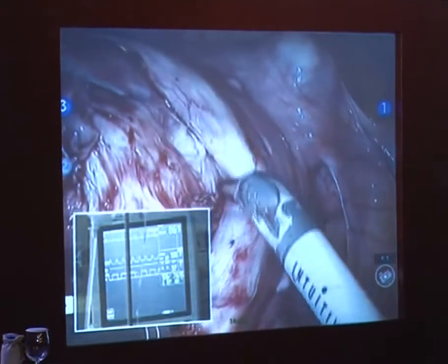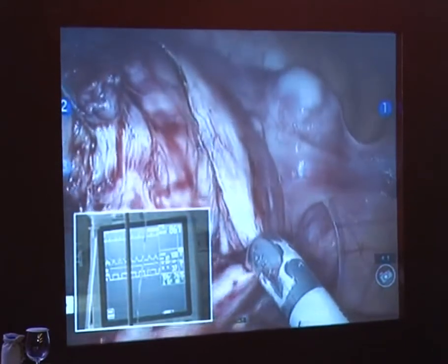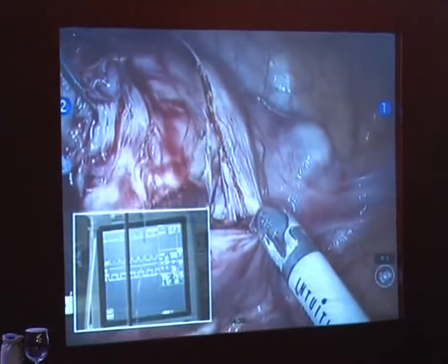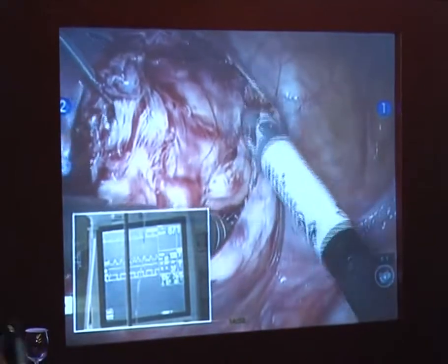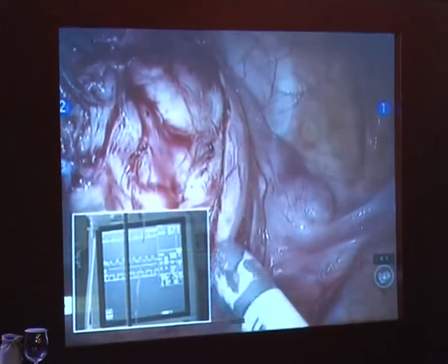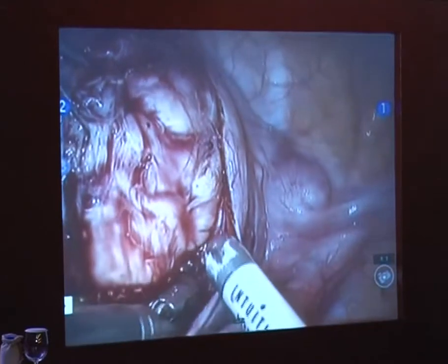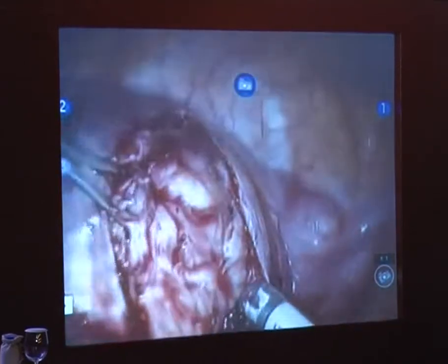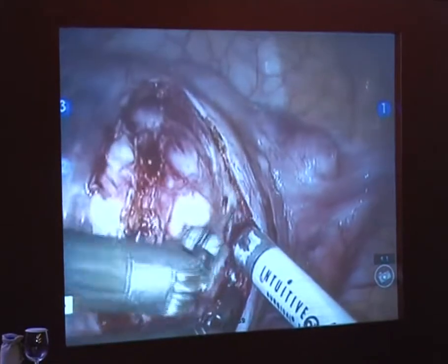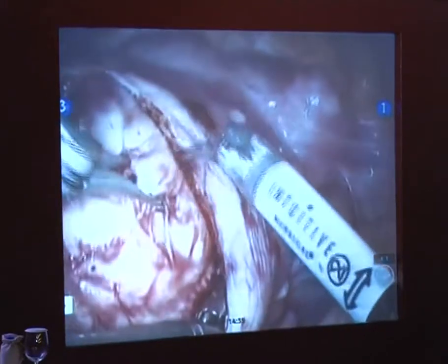And the one thing I've learned through the years of doing myomectomy with the robot is that you have to have patience, because it will eventually come out. You don't want to rip it out of the defect, because then you end up chasing bleeders the whole time. So you can see this is going to eventually give. It just needs a little bit of TLC to get it to come. So I'm gradually presenting more and more of the myoma to myself, constantly angulating it. You can see it's a pretty good sized one.